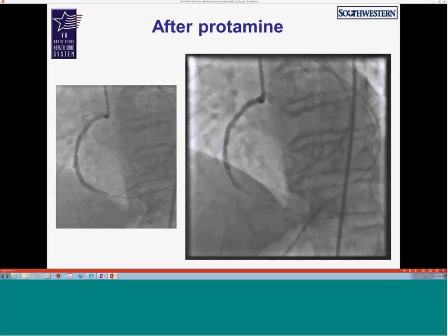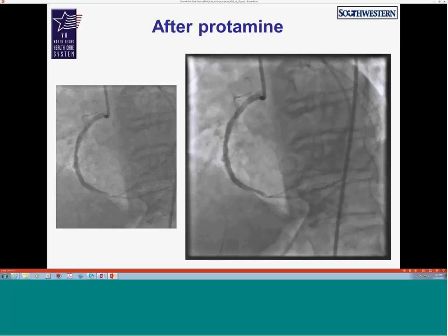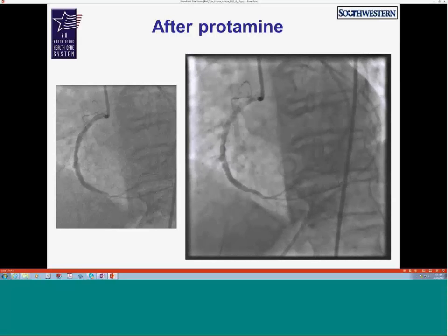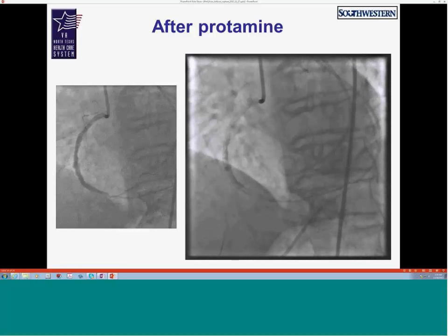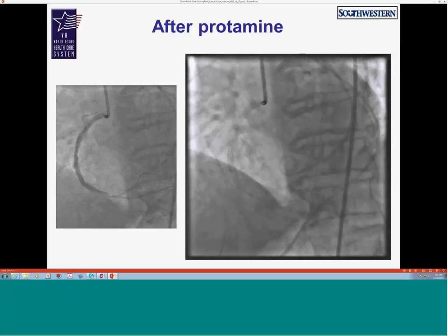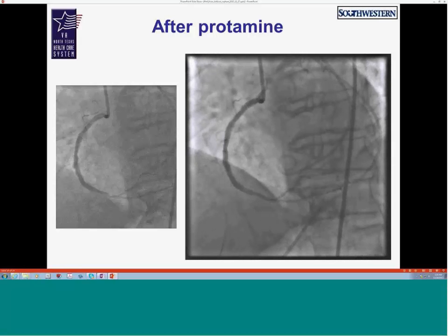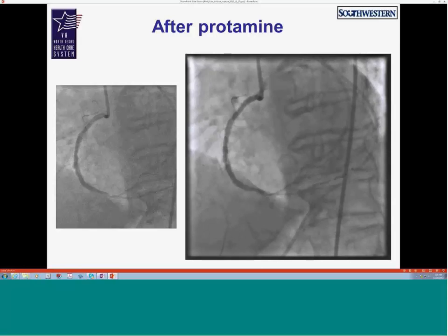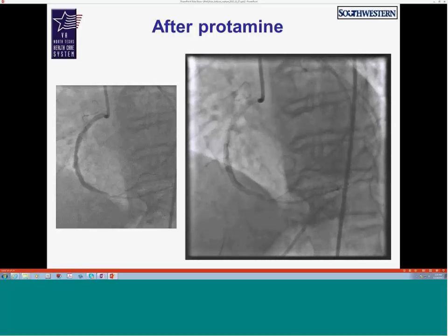No, I've seen one case in Piedmont when I was starting doing this. They did like 8 cases in 2 days. The last case, they were celebrating, opening the champagne, and they took pictures, and they got exactly the same picture you show us today. And it was a reverse CART. So I think you're right about the mechanism of the perf. I think these vessels are so diseased that it's hard to get a good result at the end.